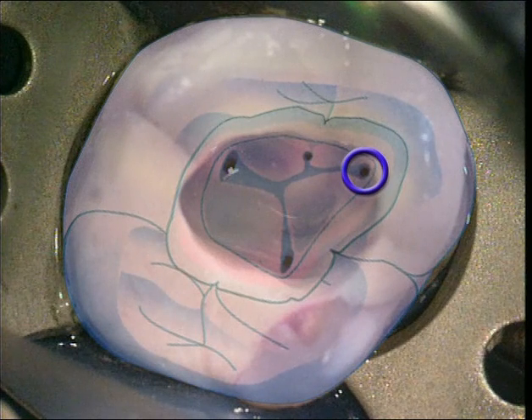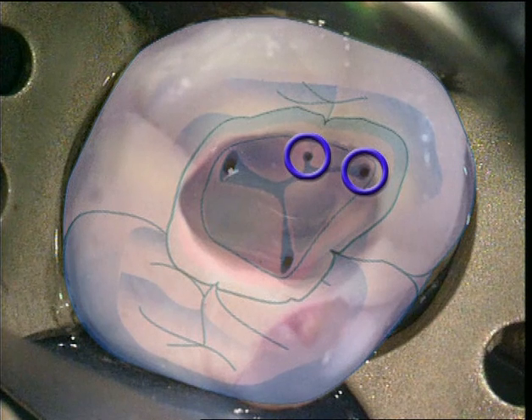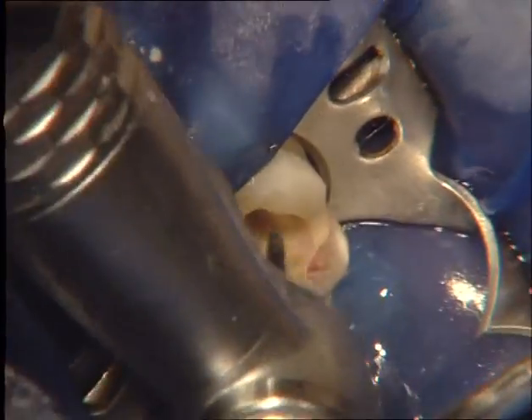Studies have shown that the mesiobuccal root manifests two root canal systems in approximately 90% of the cases. By carefully removing secondary dentin towards the palatal side of the mesiobuccal orifice, an MB2 system can often be found with the endodontic explorer.